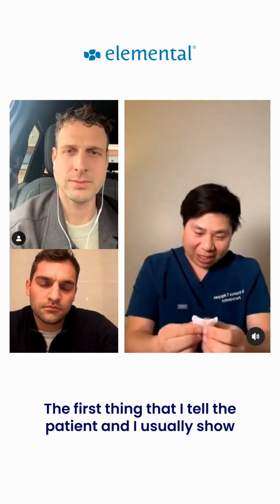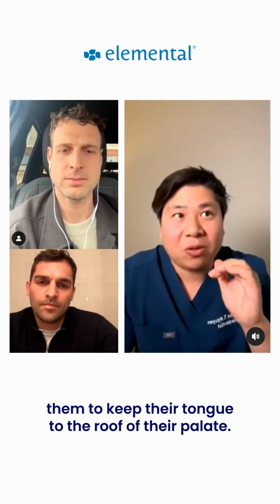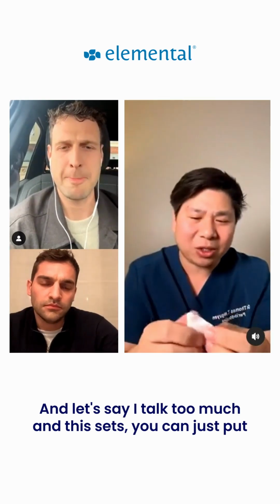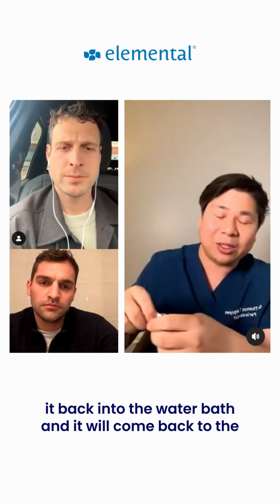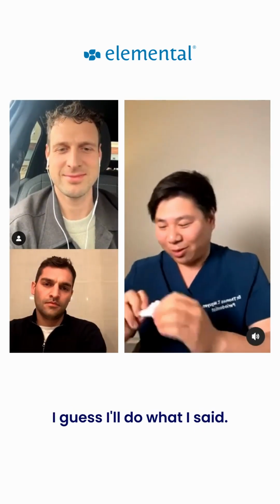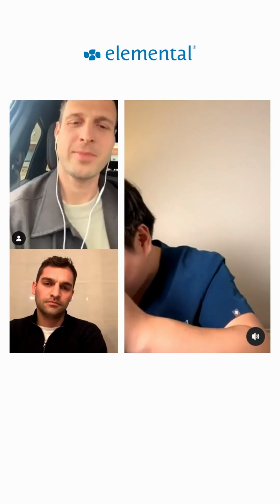The first thing that I tell the patient, and I usually show them the video first, is it's extremely important for them to keep their tongue to the roof of their palate. And let's say I talk too much and this sets, you can just put it back into the water bath and it will come back, you can mold it again. I'm just going to put it down a bit.